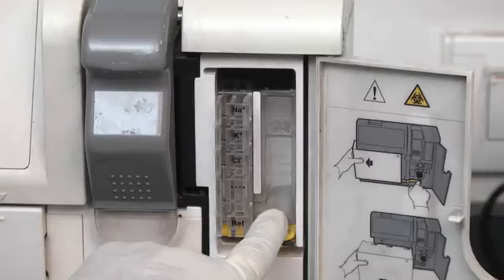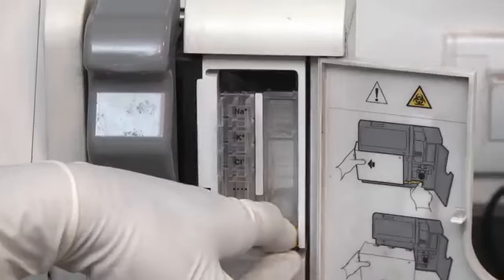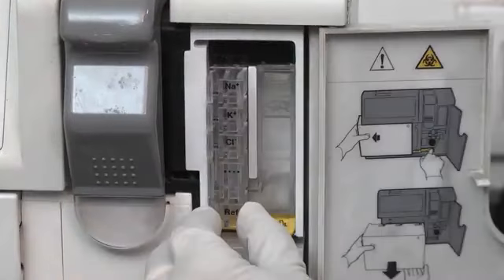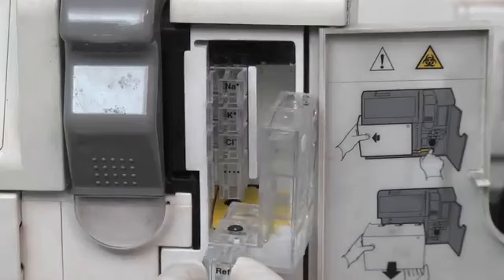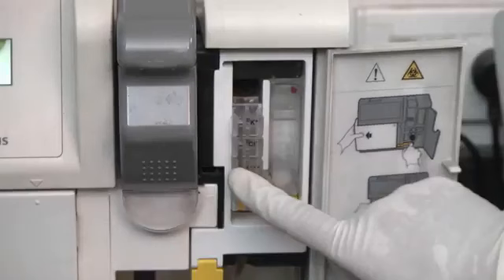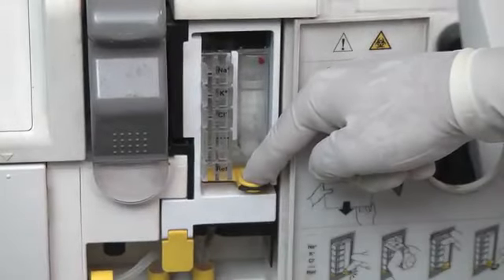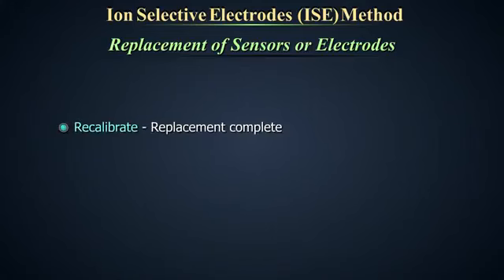To remove a sensor, push the compression plate down until the latch locks into the open position. Grip the desired sensor handle, squeeze and pull it straight out from the sensor module. To install a new sensor, push the sensor gently into its designated slot till the handle snaps into the sensor module. Do not force. Recalibrate when replacement is complete.